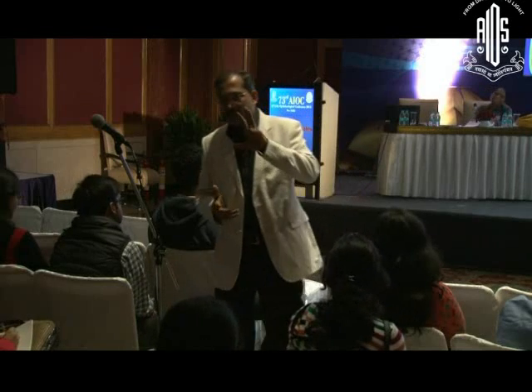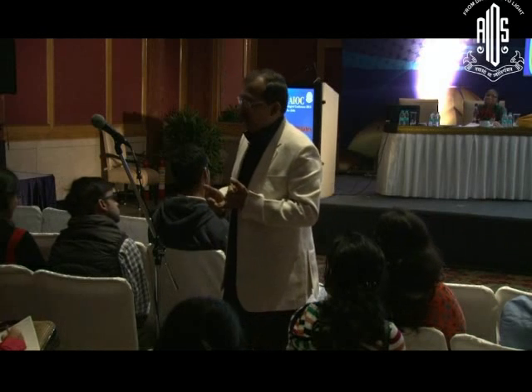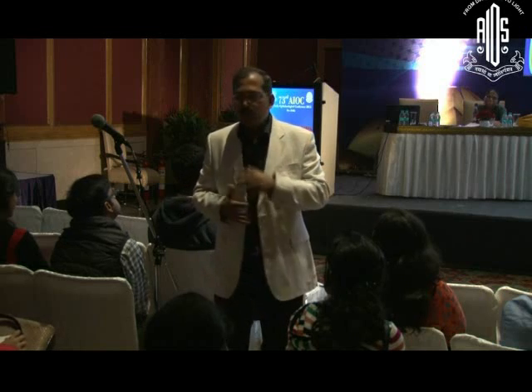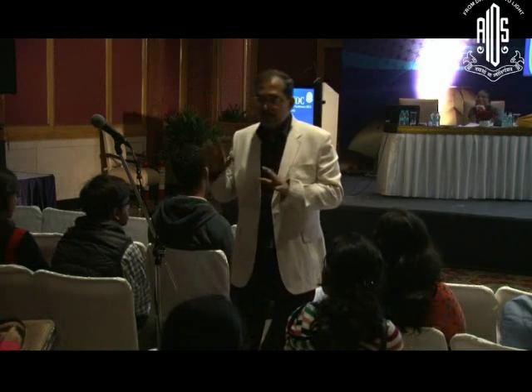Number three is multifocal lenses. Multifocals, again, two types, refractive and diffractive. Refractive is basically where there are different zones of power. The problems of refractive multifocals are they are pupil dependent, but the advantages are they cause less decrease in contrast sensitivity and they are good for distant vision. Whereas diffractive are pupil independent, but they cause a lot of loss of contrast. So you can actually combine both in the dominant and non-dominant eye, called mix and match also. Next is accommodative.